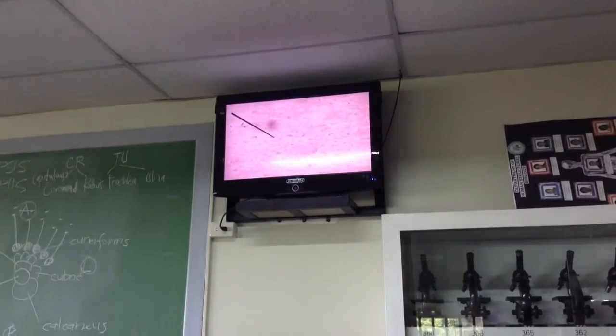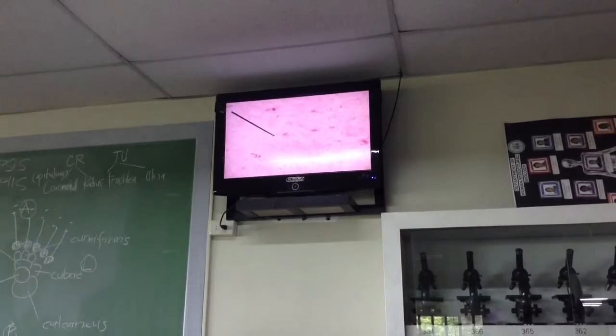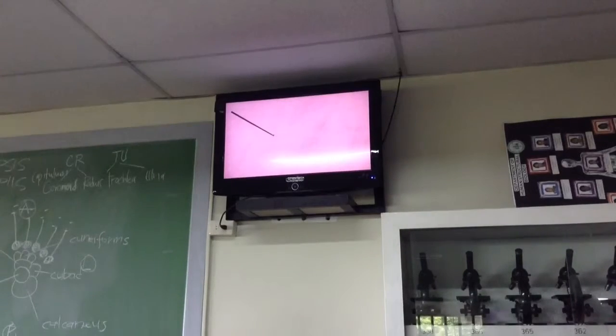So this is the intervertebral disc. Okay? So all the dots you're seeing there are the chondrocytes. Hindi na sila isogenous or singly arranged. They are arranged in rows. Not apparent on this particular slide. Pero in some slides, you can see that they form parang single file. Nakapila sila. In rows?